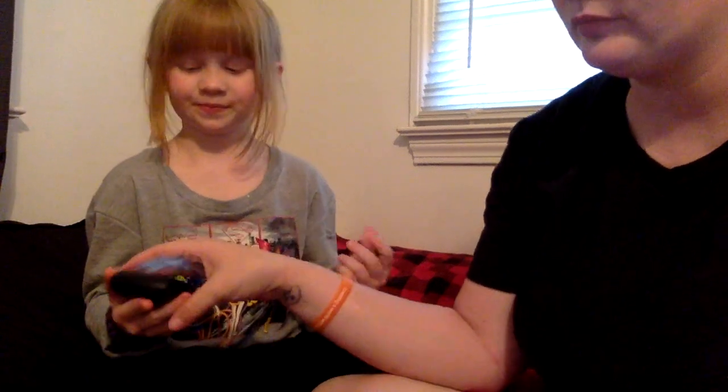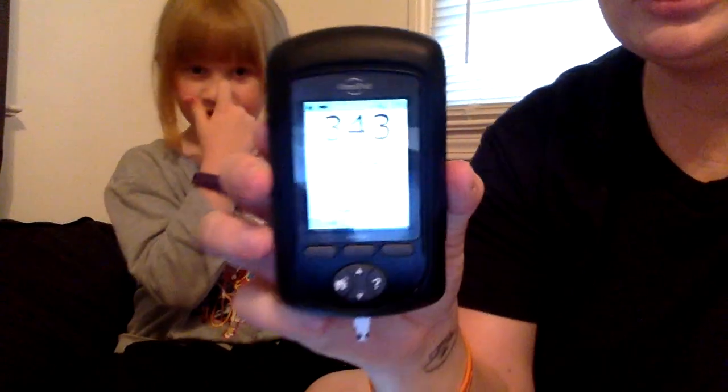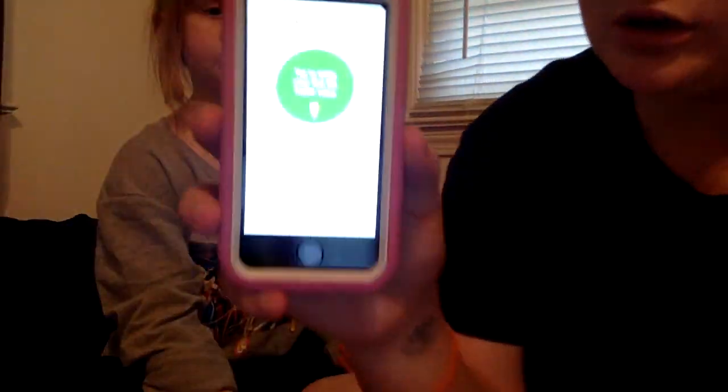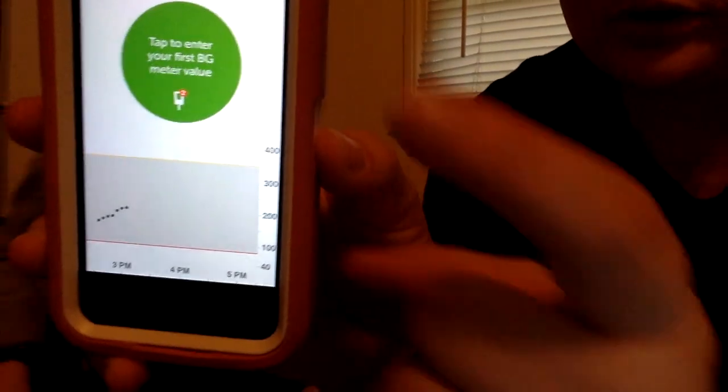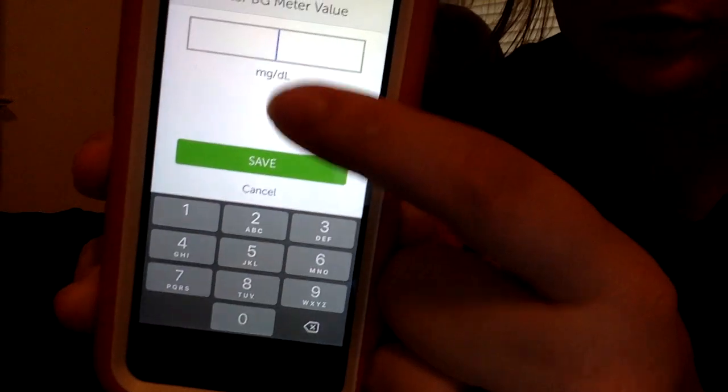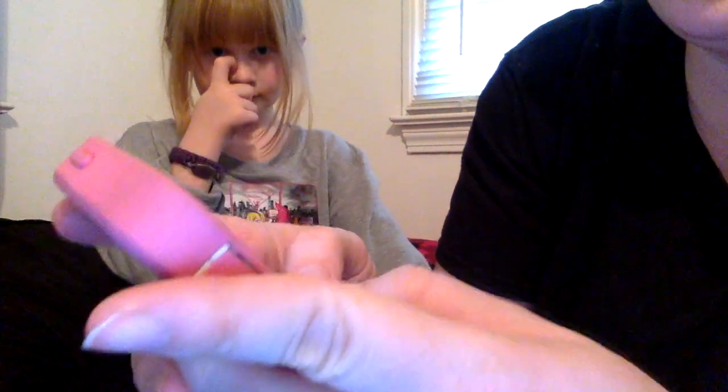Now I'll need one. Okay, so her blood sugar is a little high, as you can see, because she just ate not too long ago, but we can still calibrate it. So what we'll do is we'll come to her phone, and it says tap in her first blood sugar meter. And we tap. And then it was 343. We'll save it. All right, now Sophie, do it again.